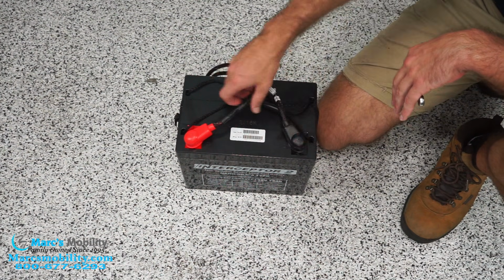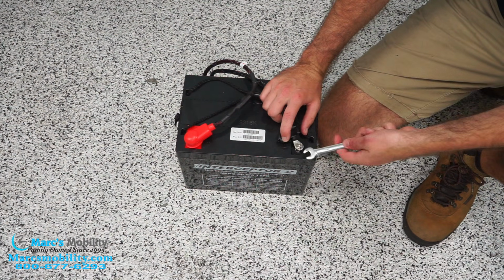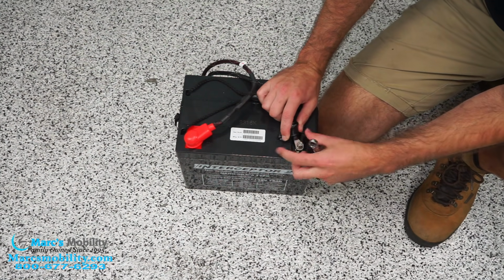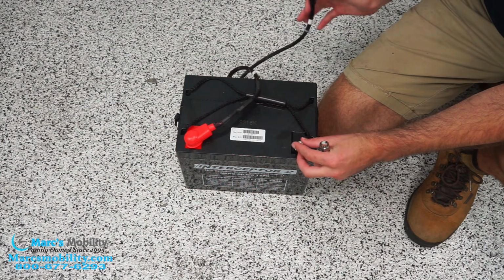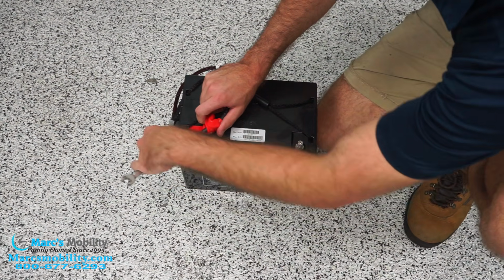So now I'm going to take this cable off of the old battery. These are recessed posts. They take a 10mm wrench. We're just going to loosen this. Then we'll take our terminal off. Same thing on the other side.